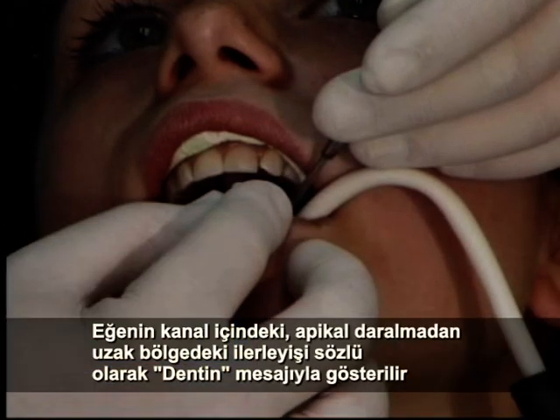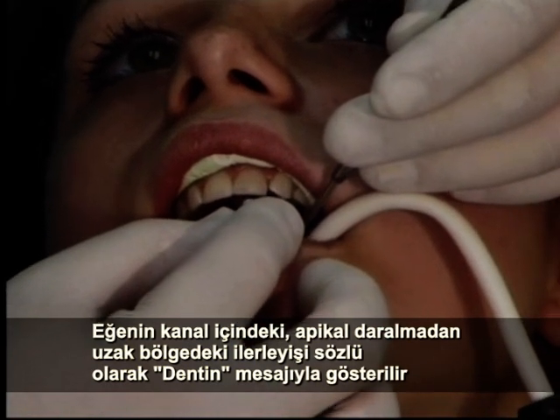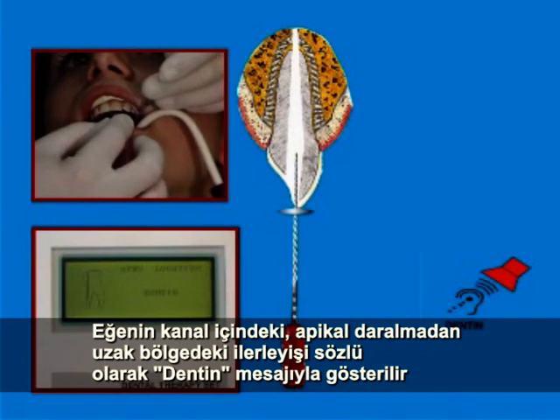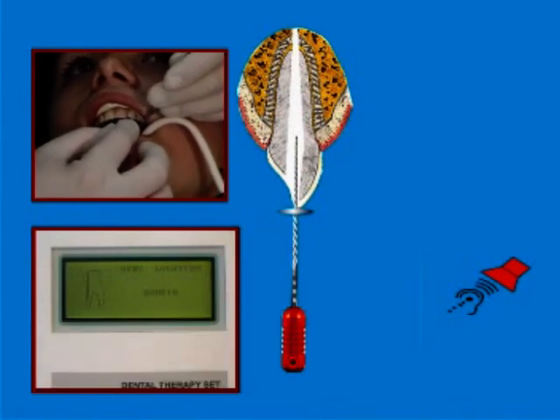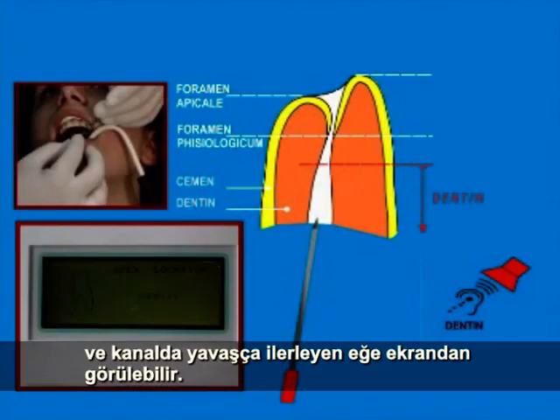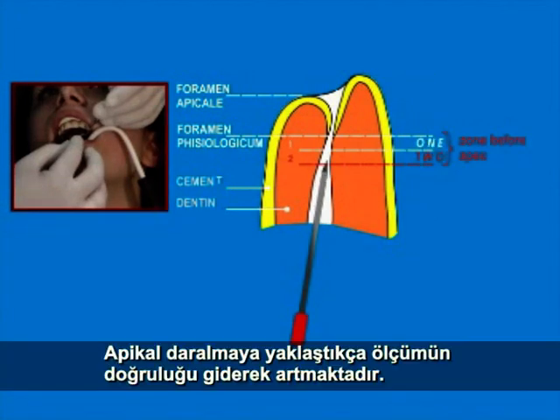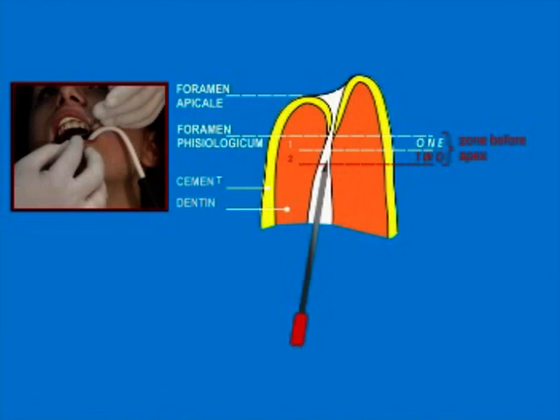The file penetration in the canal, relatively far from the apical constriction, is indicated by a spoken message, dentin, and the file gradually penetrating the tooth can be seen on the display. Approaching the apical constriction, the accuracy improves greatly.